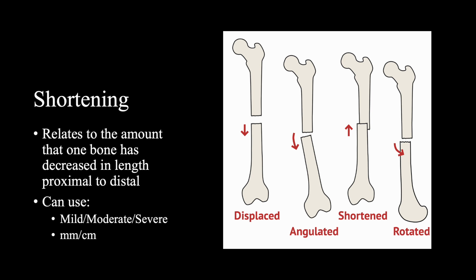There are a lot of great YouTube videos that go way more in depth on how to speak about a fracture that way. However, this is just a broad overview working on understanding the different terms. Nail Fracture Conference also has a great course, and they show you hundreds of x-rays, and they give you the opportunity to describe them. So it's a great resource as well.